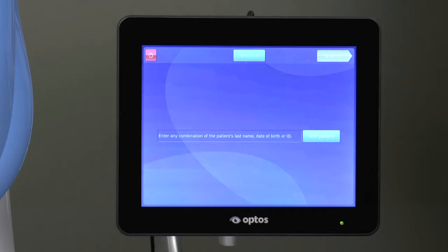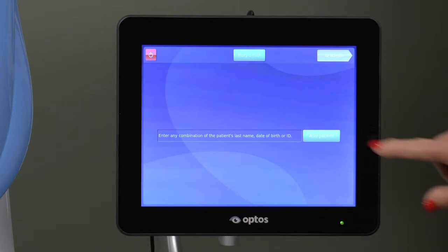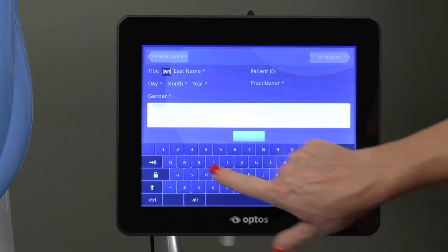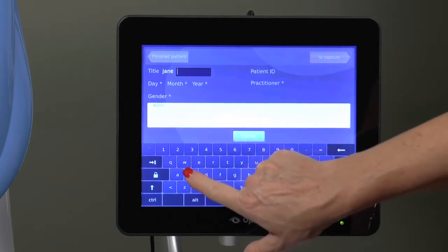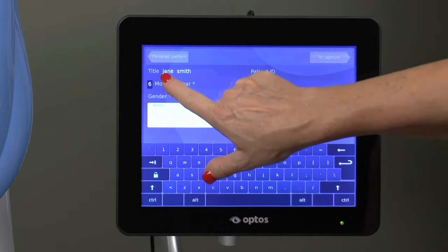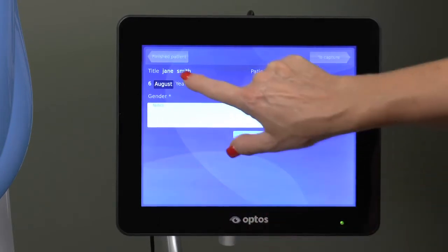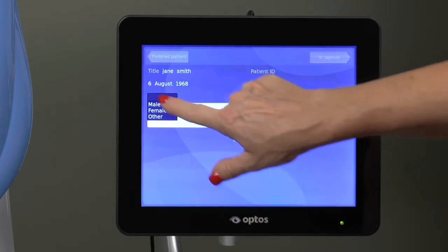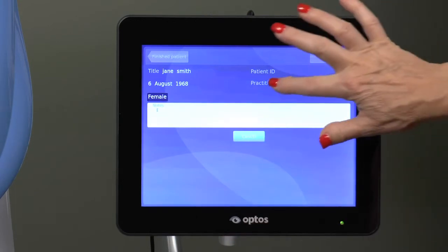This will take you to the patient information screen, where you may enter any combination of the patient's last name, date of birth, or ID to bring up an existing record. If the patient record does not already exist, you can add a new patient by tapping on the add patient tab and filling in the first and last name fields, then the date of birth field, which is in the day, month, year format. You must also select appropriate gender and practitioner from the drop-down boxes. All fields, with the exception of patient ID, must be completed in order to proceed. If you do not enter a unique patient ID, one will automatically be assigned.